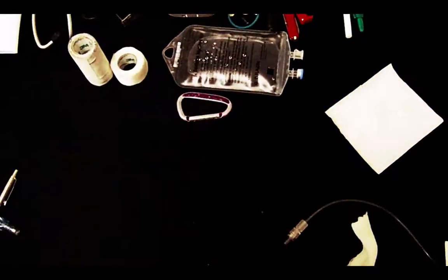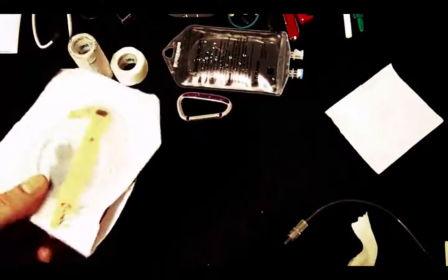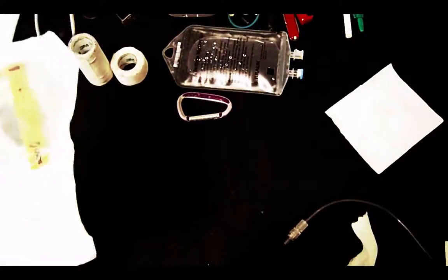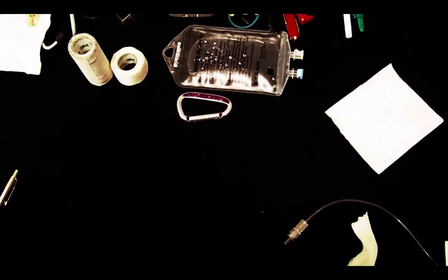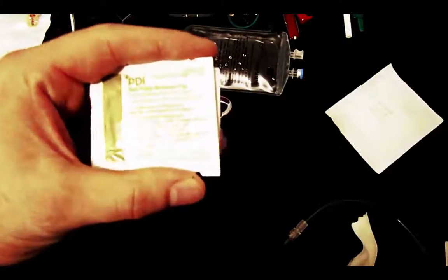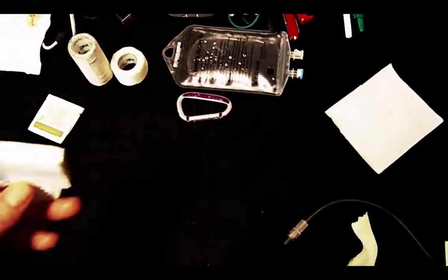Another item I carry is a neonatal pulse oximetry probe. You can use it on neonates, but it's also useful when ICU patients have poor perfusion to their distal extremities and you get no reading on your monitor. Because it's flexible, you can tape it around the earlobe and potentially get a reading. I also carry nail polish remover — this is more applicable on scene calls. If a patient has thick nails with nail polish and your pulse oximetry isn't reading, you can use this to remove the nail polish.